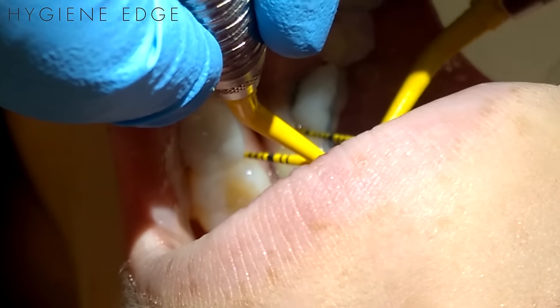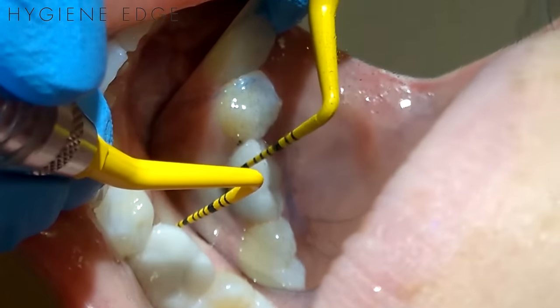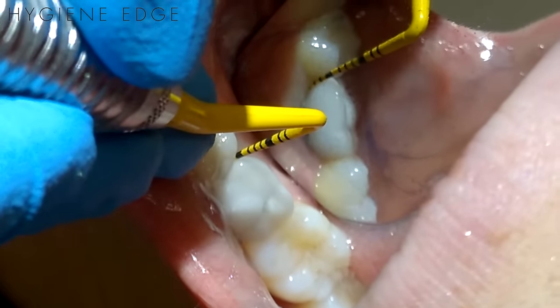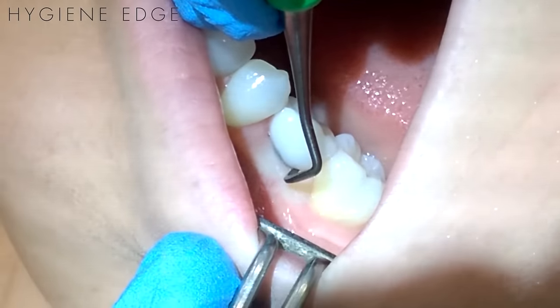When scaling an implant, you must choose an instrument that won't scratch it. Plastic scalers used to be all that was available, but gratefully technology has progressed, and now we have instruments that can actually remove calculus, such as this 204S from American Eagle Instruments, which is made specifically for scaling implants.